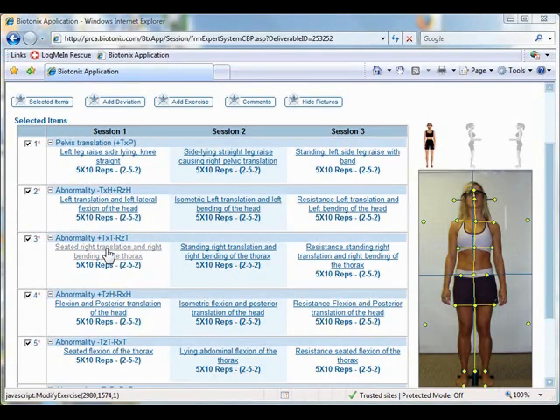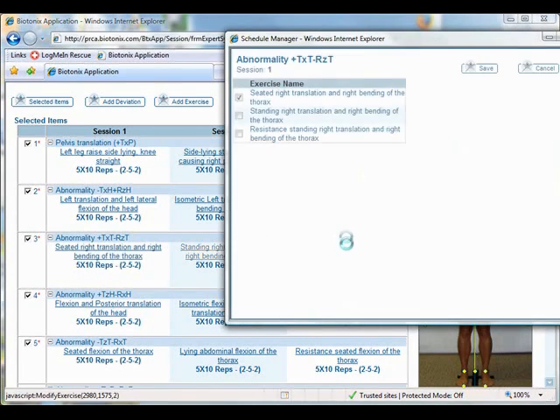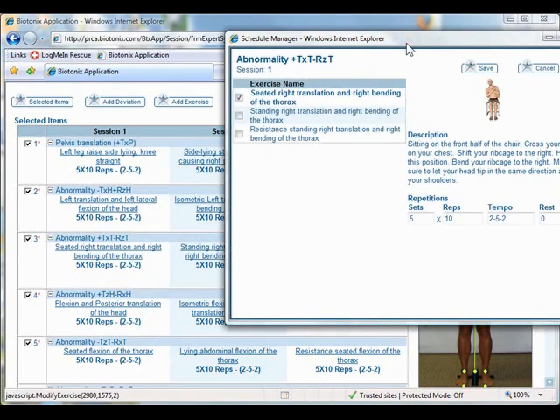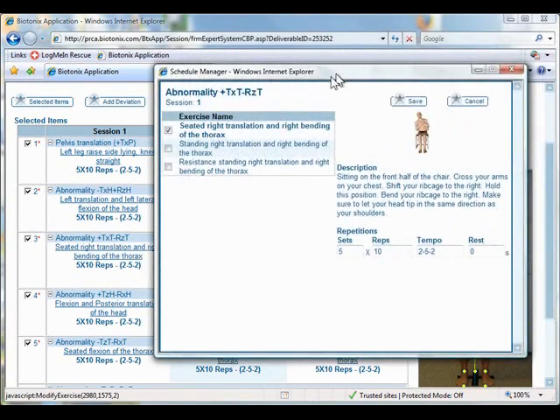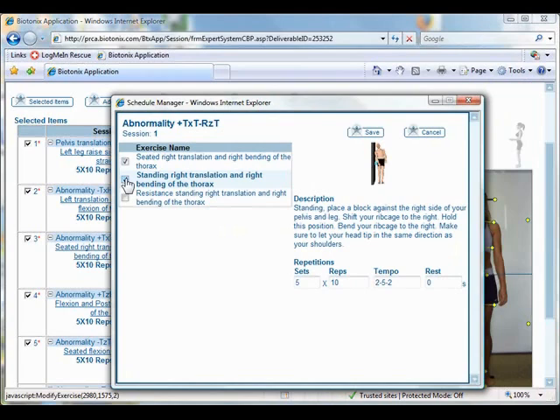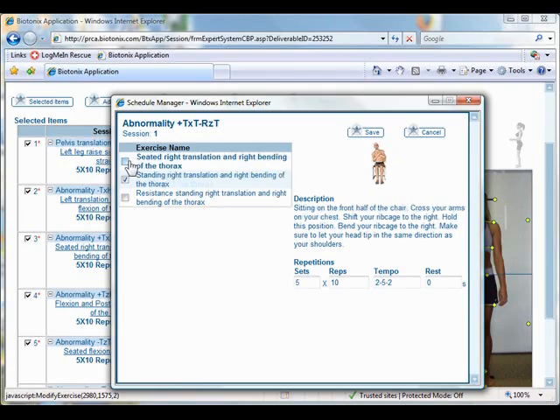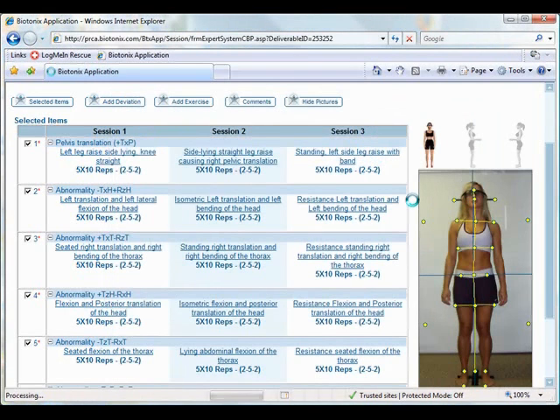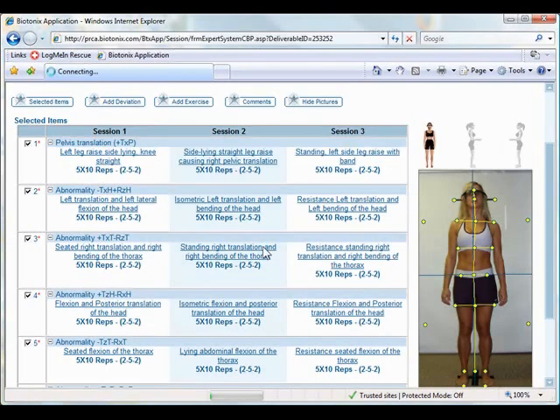If I open that up, I can go ahead and change this exercise if need be. So, you can see that it automatically prescribed the corrective exercise for the patient. If I need to make it a little bit more advanced, I can make it more advanced, as it shows the standing exercise. I can change the sets and reps for the patient. I can change the tempo if I need to. Then I'm going to go ahead and save that. So, then it will automatically update her postural exercises, the one that I just edited.